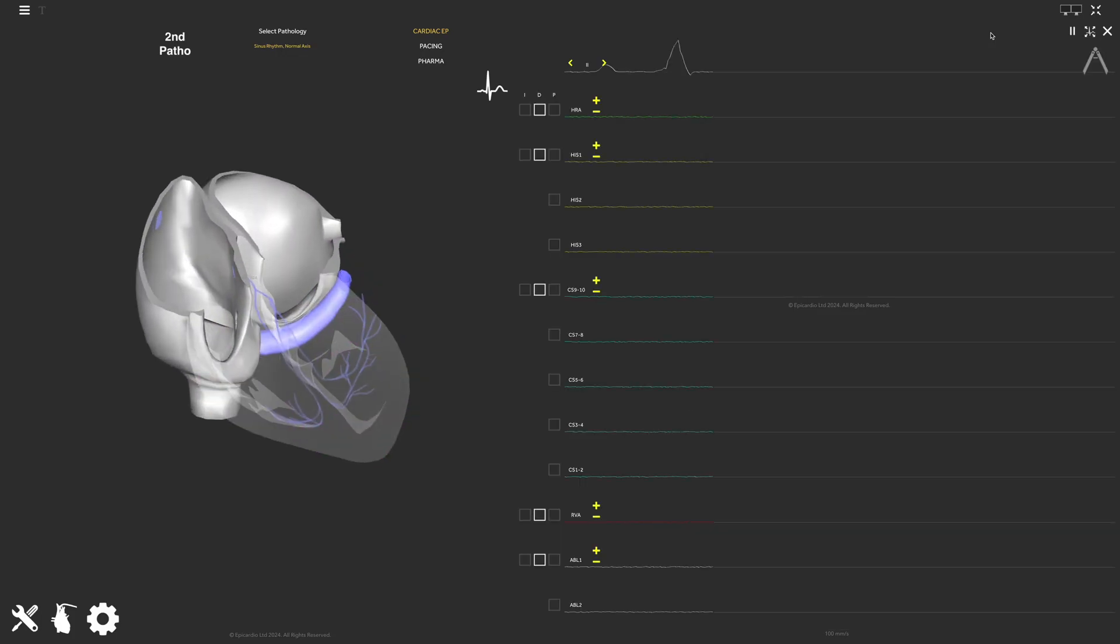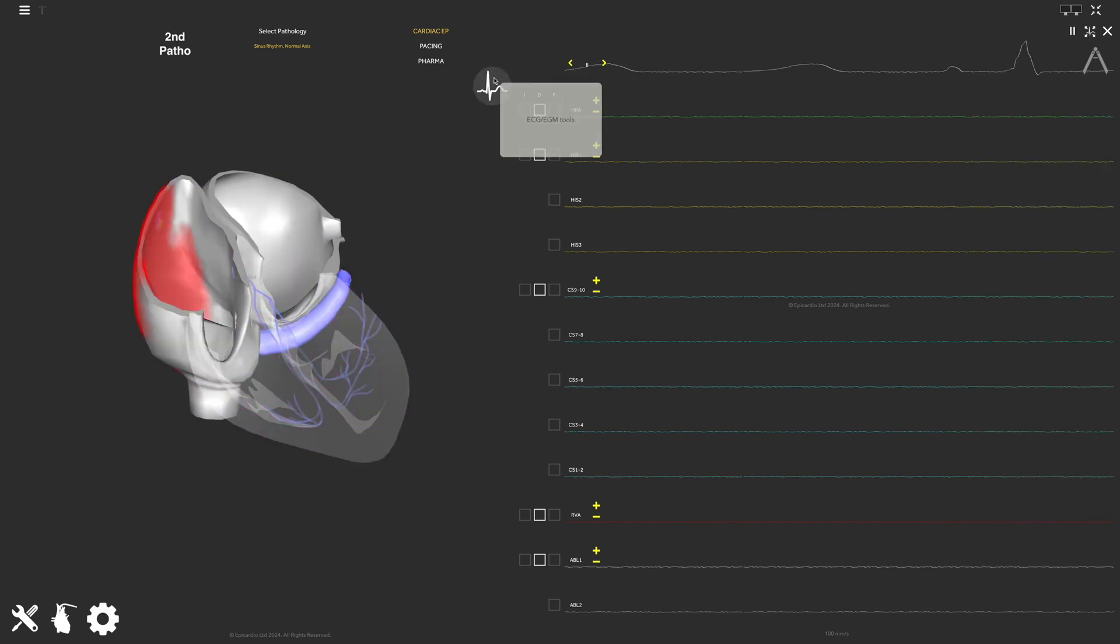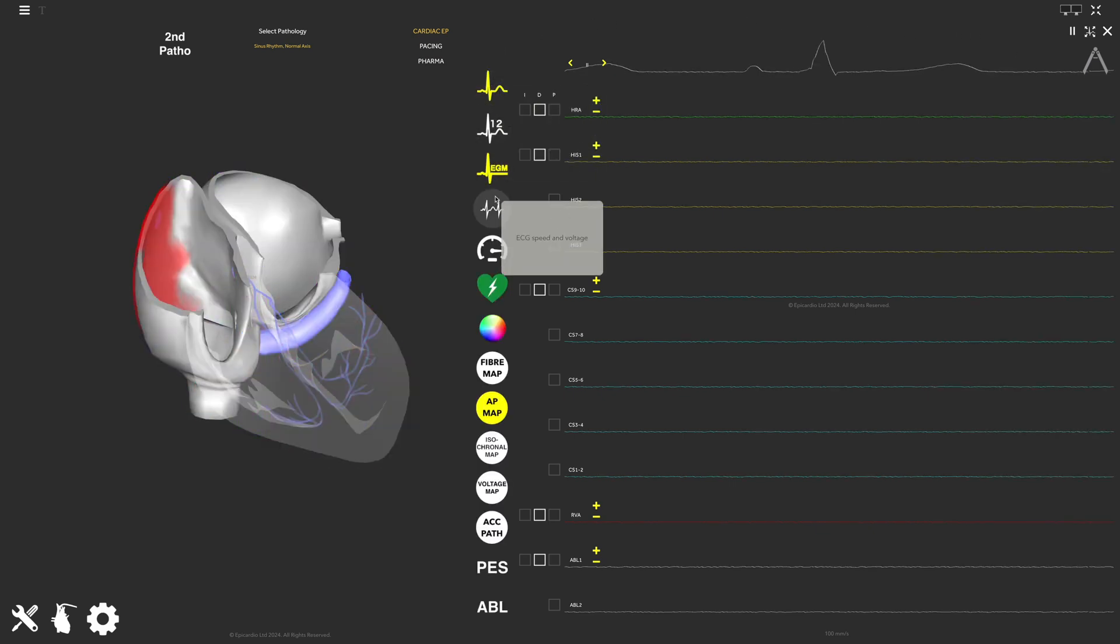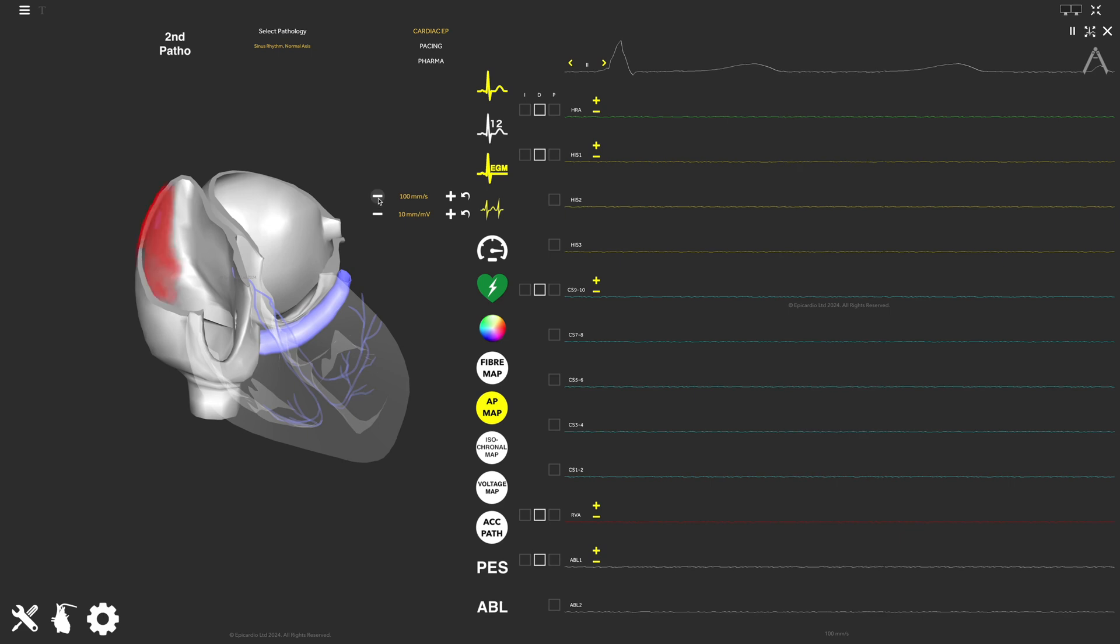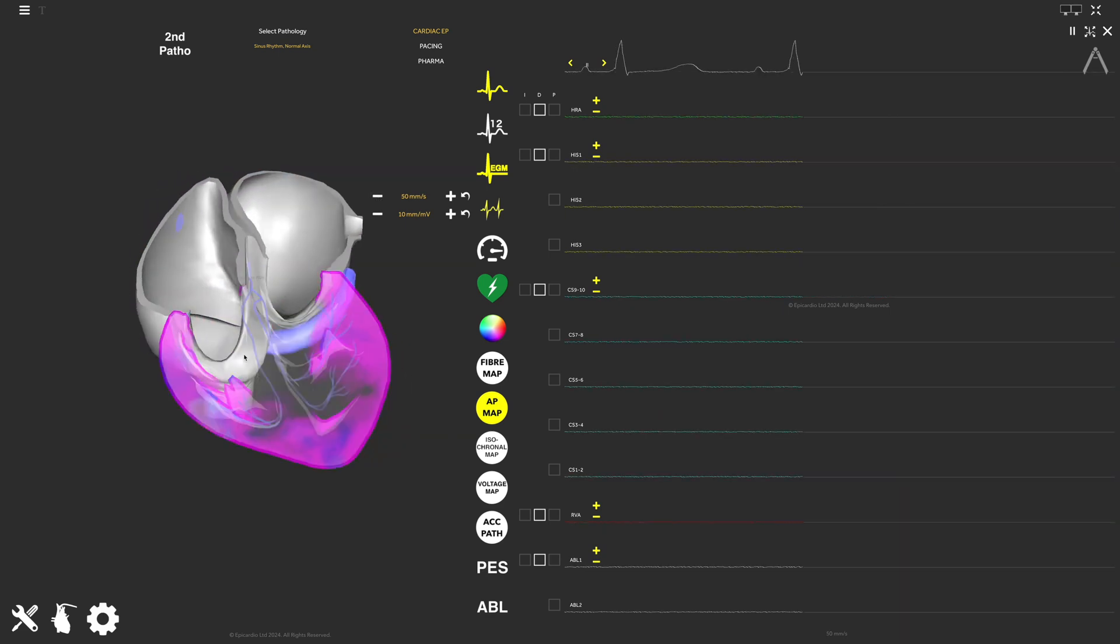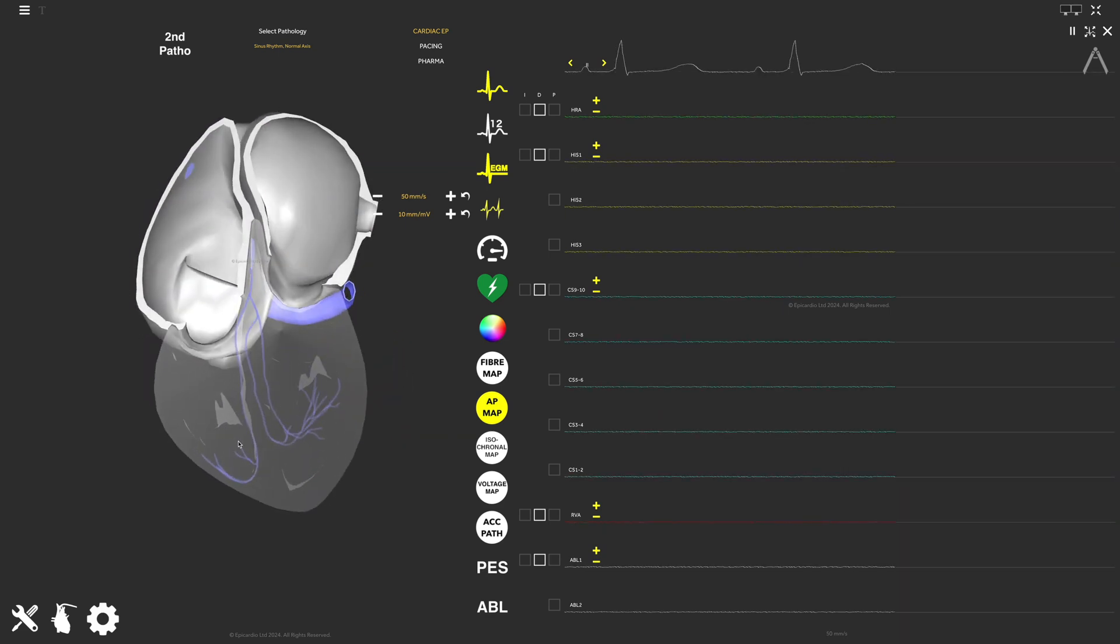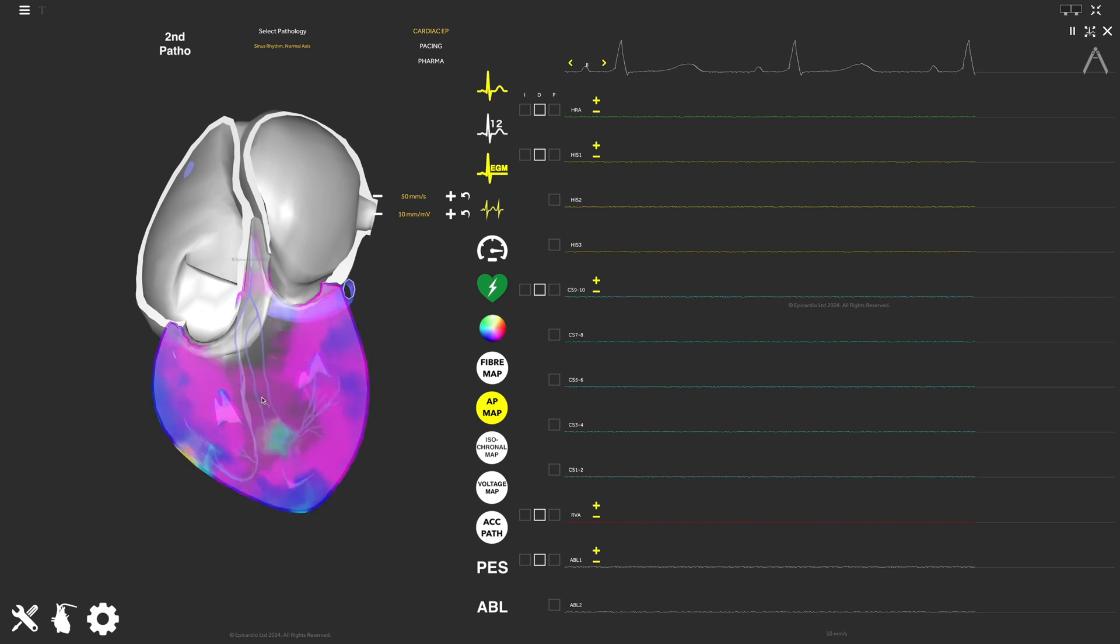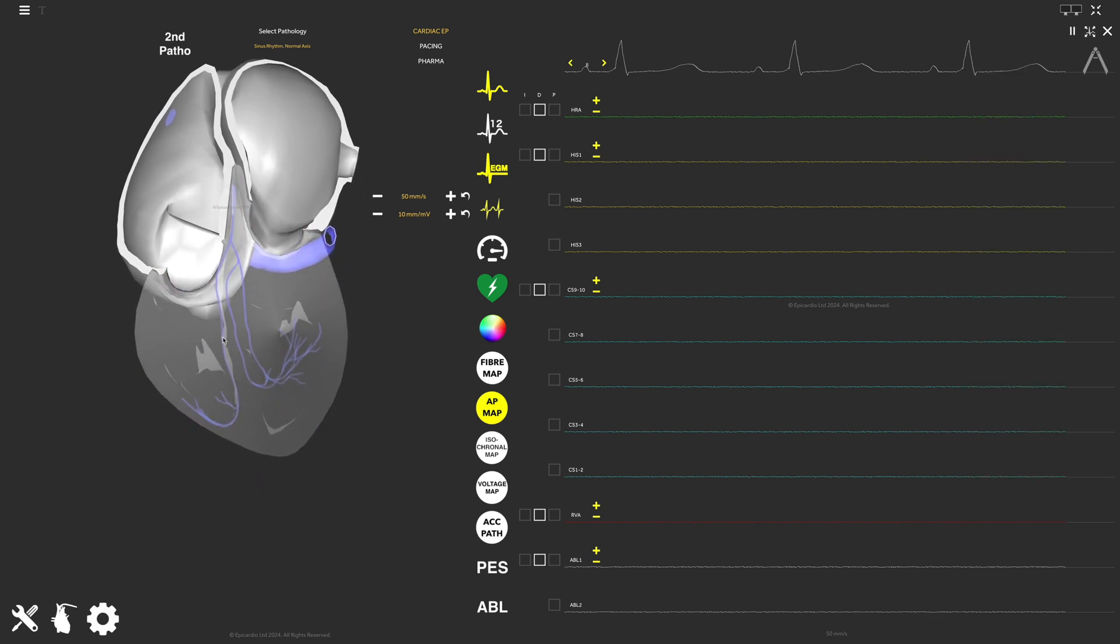You can change the ECG sweep speed here. You can adjust the view by dragging your cursor anywhere on the three-dimensional heart view.